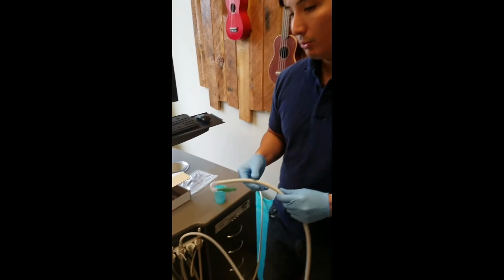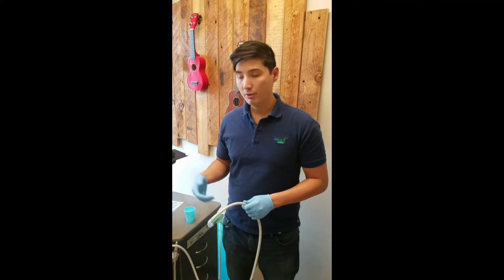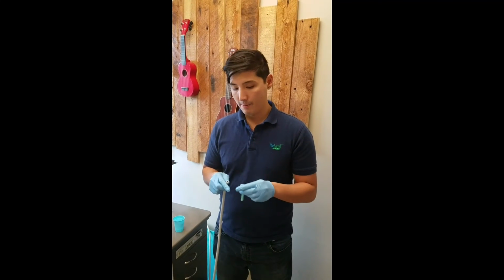Once you get used to it, it takes about 10-15 seconds to set this up. Transferring through patients is really easy. Just simply take the U-bend off and put another one on.